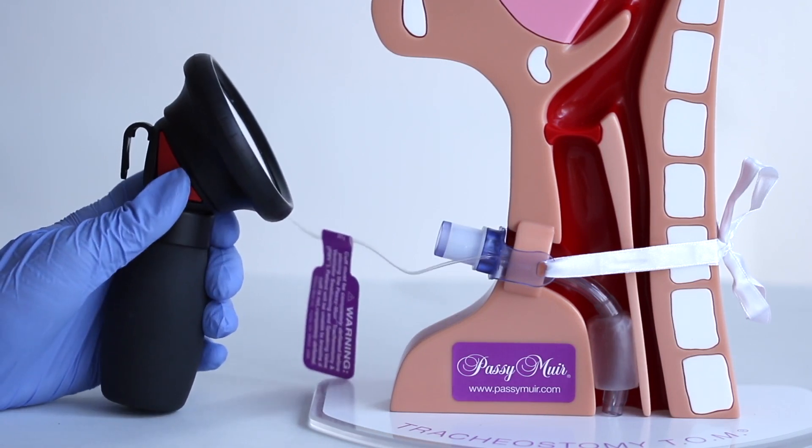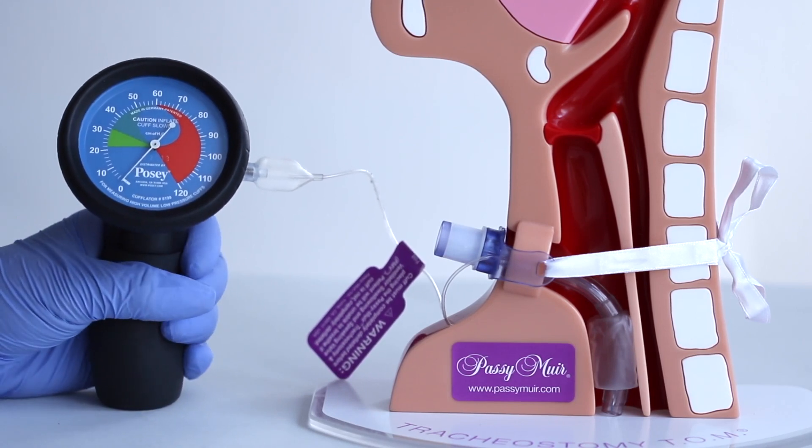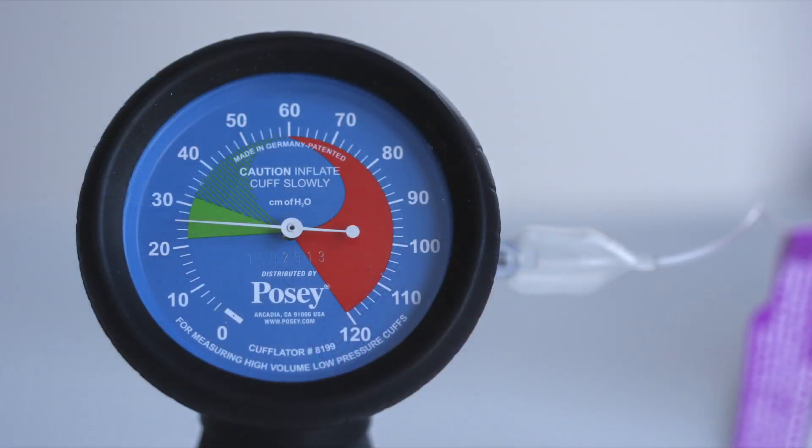The red air vent button located on the back of the manometer can be depressed to release air if the pressure is too high. Recommended cuff pressure is highlighted in green on the face of the gauge.